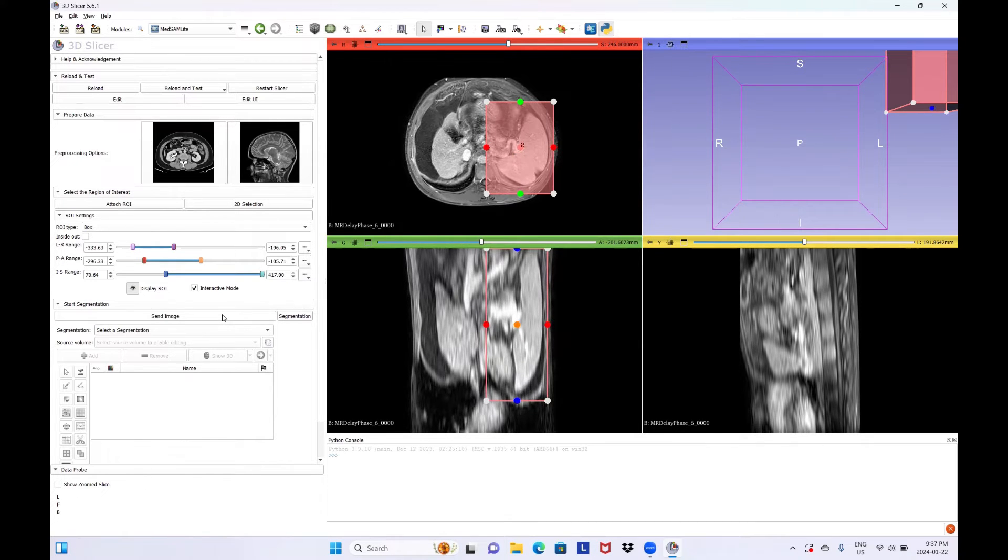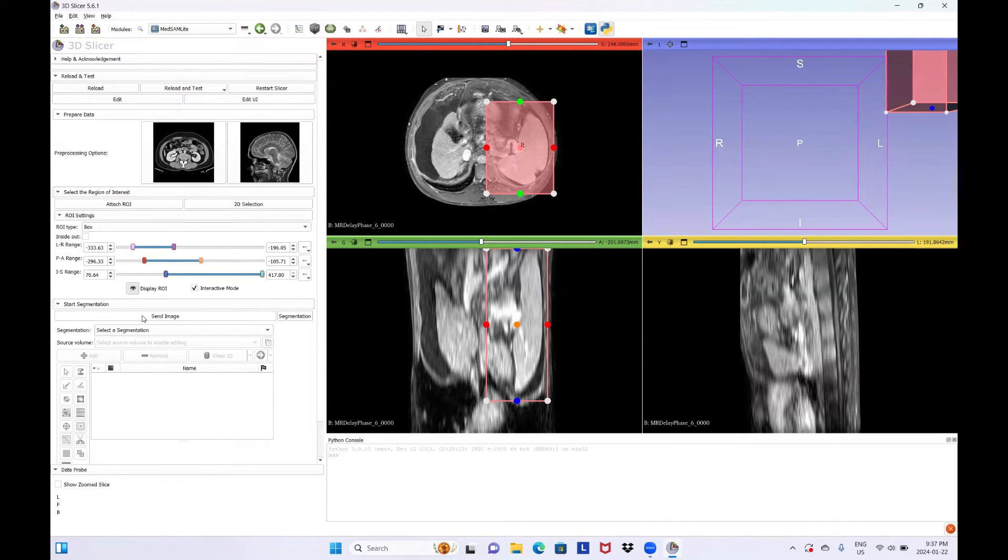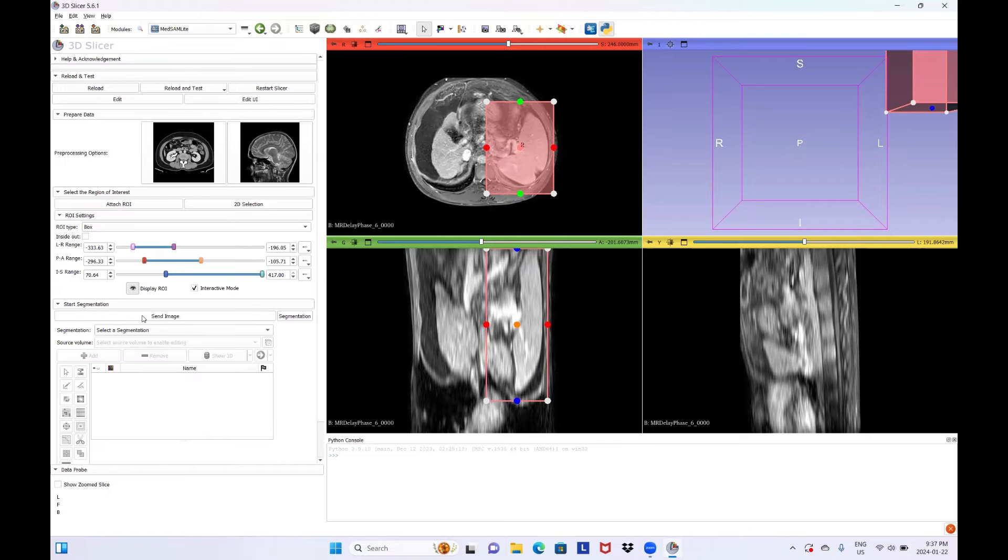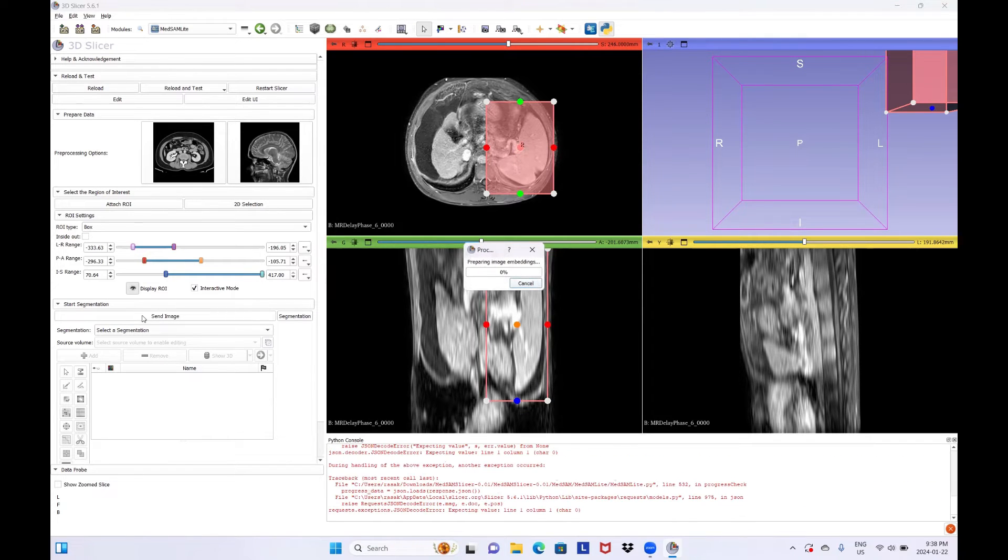From the Start Segmentation Accordion menu, click on Send Image button. It will send the whole 3D image to the backend of the module to be processed. It will take several minutes.